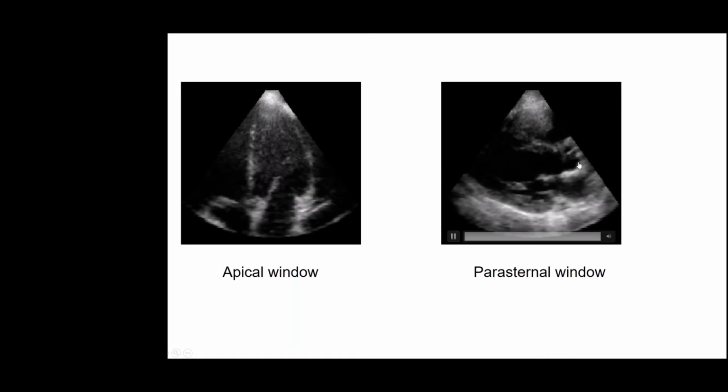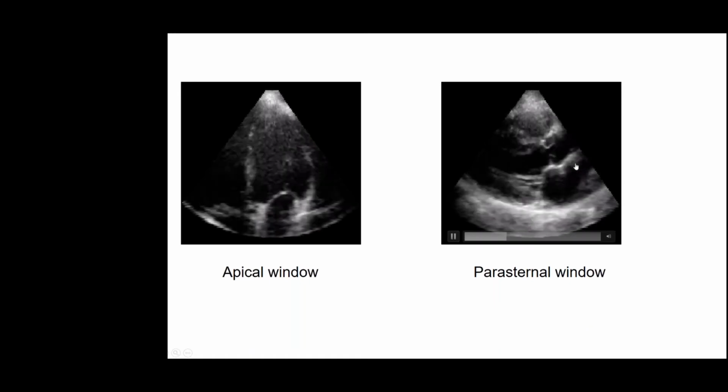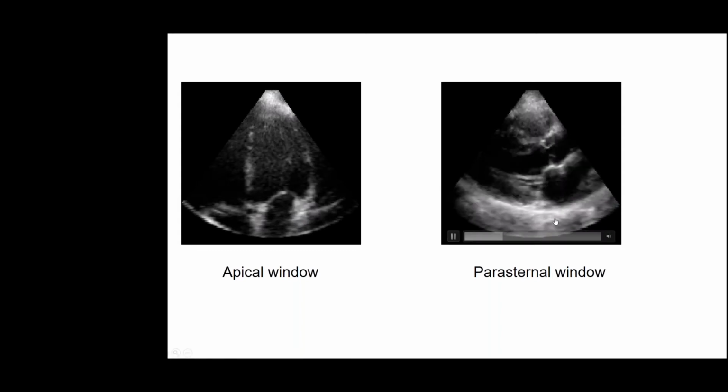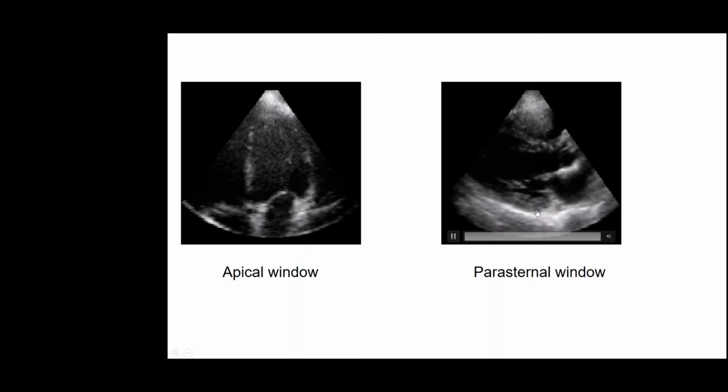And this gives us a kind of sideways, if you forgive me for not using the proper clinical terms, look at the heart. So this will be the left ventricle here, and here you see again the valve opening and closing in real time. So this is acquired in real time.